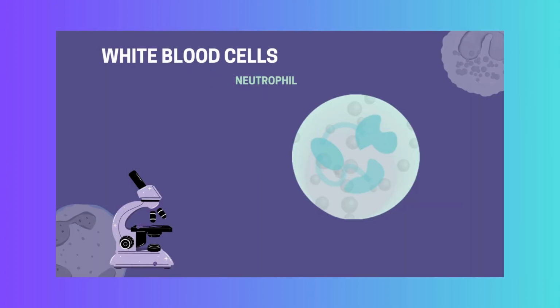Neutrophils are medium in size and are a granulocyte. They have small granules present in the background. These granules are very fine and may be difficult to distinguish. The most noticeable characteristic is the multi-lobed nucleus, which typically has anywhere from 2 to 5 lobes.